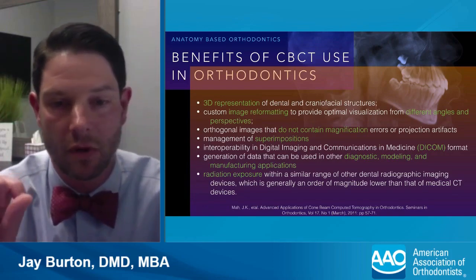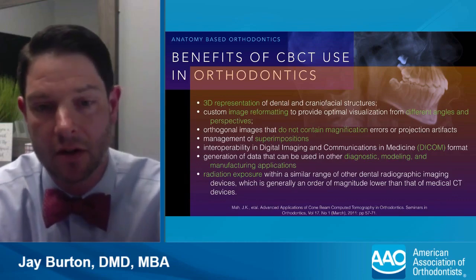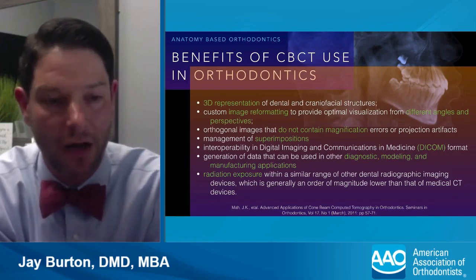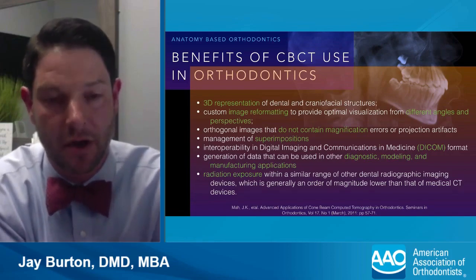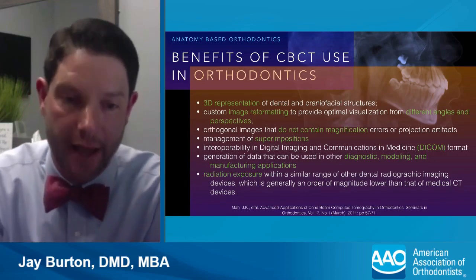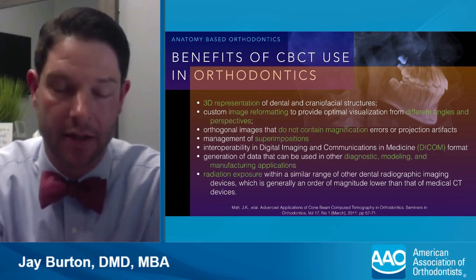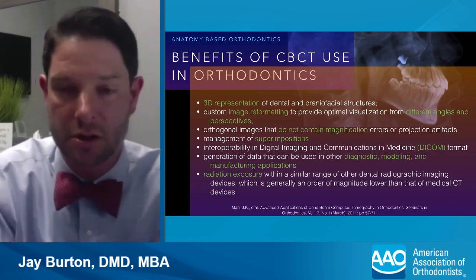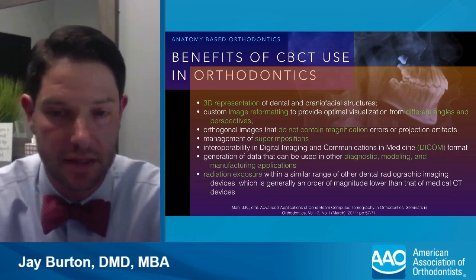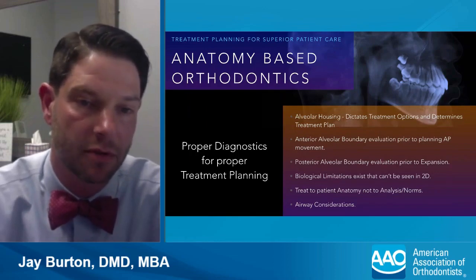The ability for diagnostics, modeling, manufacturing, and then ultimately, and this is back before ultralow dose had come out, the radiation exposure was within the norms of other radiographic imaging. Well, now it's less than other radiographic imaging modalities. So there's certainly a vast majority of benefits to CBCT in your practice. And at the end of the day, it allows for proper diagnostics and proper treatment planning.